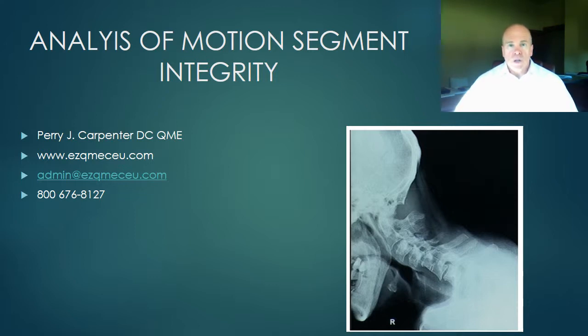And once you get the procedure established, it's actually quite simple. It simply involves, number one, ordering the necessary studies from the imaging facility. Number two, instructing the imaging facility on exactly what you need in order to get the images proper so that you can make the necessary measurements on those images.